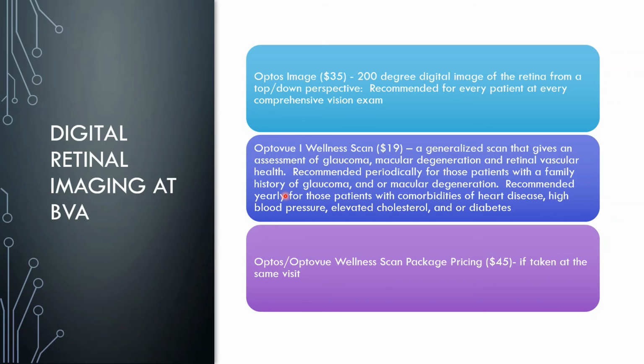So I encourage those of you who do have heart disease, high blood pressure, cholesterol issues, diabetes issues, I really, really advise that both of these imaging scans, if you will, be done at every visit, every yearly visit that you come in. And those of you who have a strong family history of macular degeneration and glaucoma, really important that maybe every few years that you get a wellness scan in addition to the Optos.